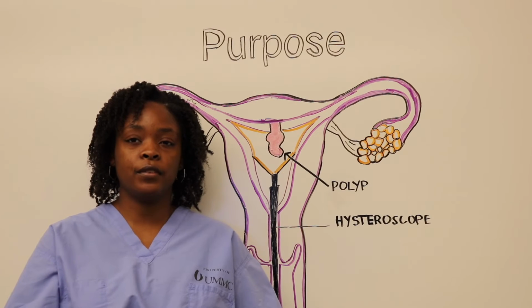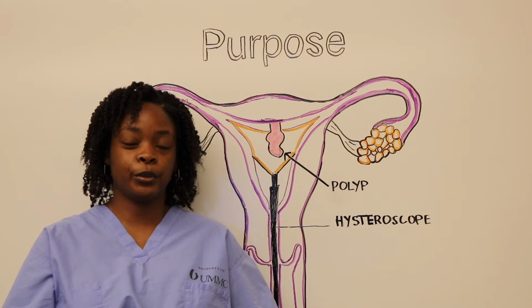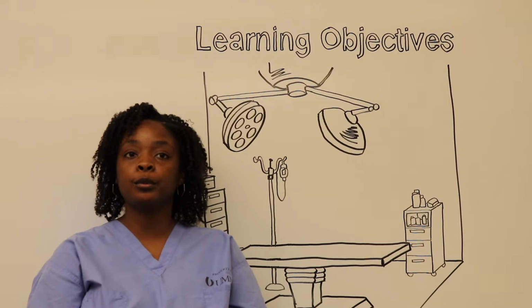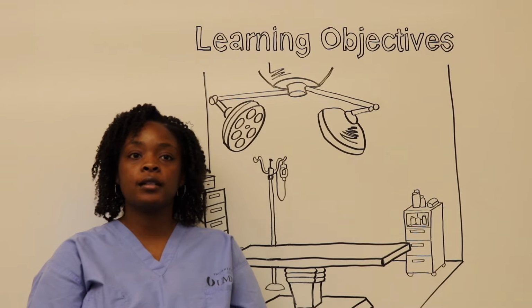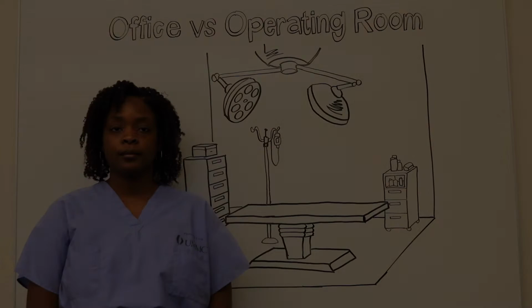The purpose of this video is to discuss the prevention and management of complications during hysteroscopy. After watching this video, residents and medical students should be able to list the contraindications to hysteroscopy, discuss pertinent preoperative planning, and identify and manage hysteroscopic complications.